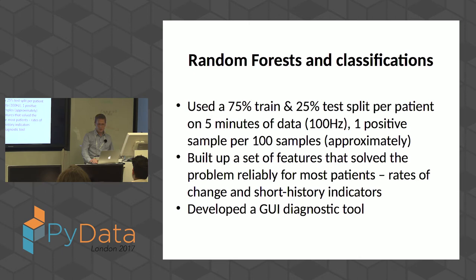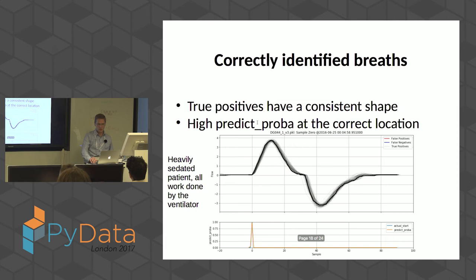So in order to diagnose our results, I developed a diagnostic tool. And here we have one view of the output from the classifier, where we have a patient who is heavily sedated, and therefore all the breathing effort is from the ventilator. So we have here approximately 75 very consistent breaths from the test set, and they've all been overlaid, and the predicted start point for each of these is accurate.